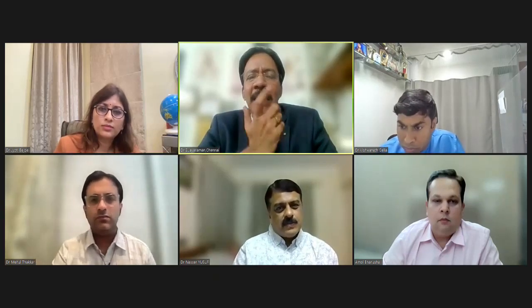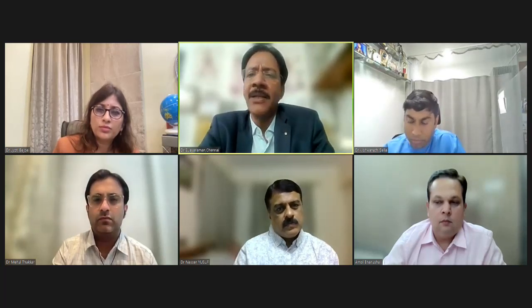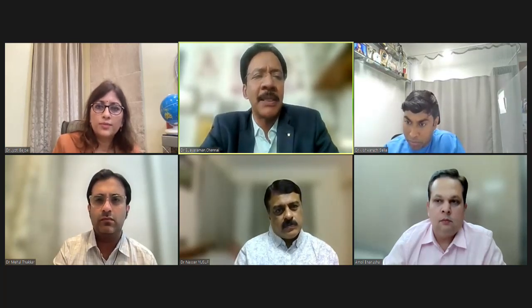Yeah, mainly the freezing effect, which causes the false negative report in the case of tuberculous pleuritis. That's why I'm saying from the beginning, cryobiopsy is more in favor of the malignancy diagnosis. For the TB diagnosis, simple forceps biopsy and culture, the yield rate is very high. Already Jyoti ma'am clearly mentioned it in her presentation.